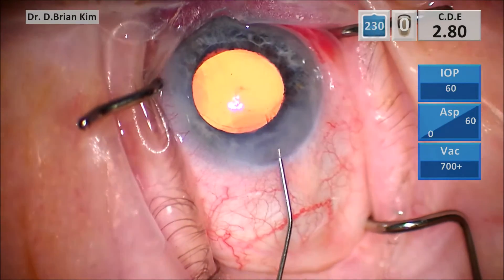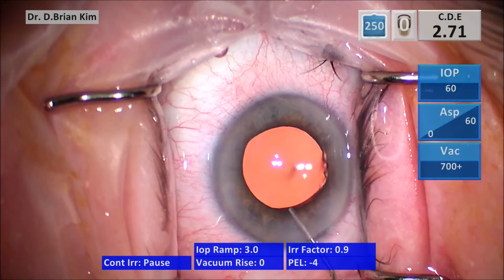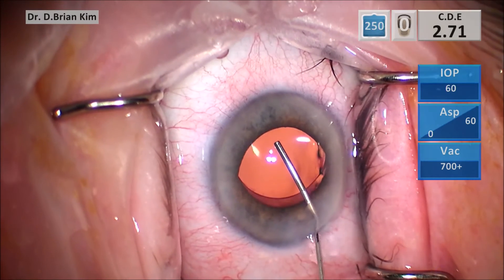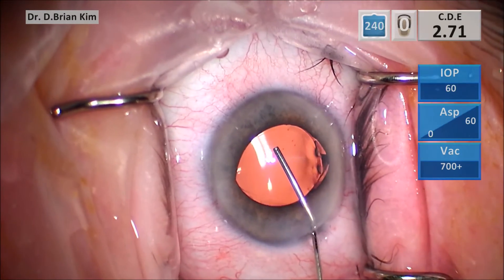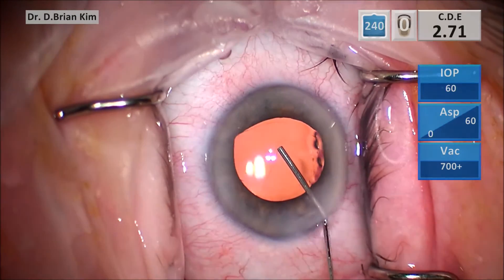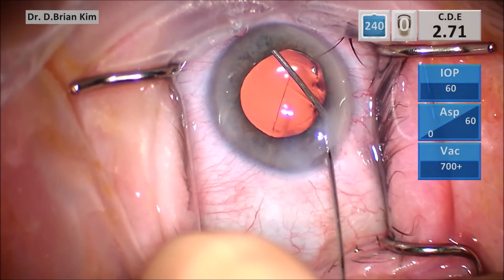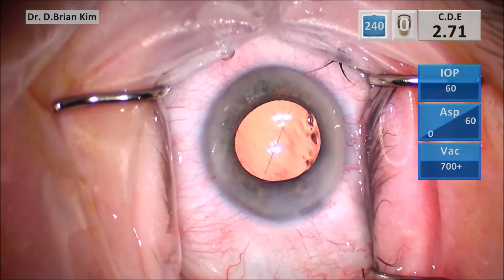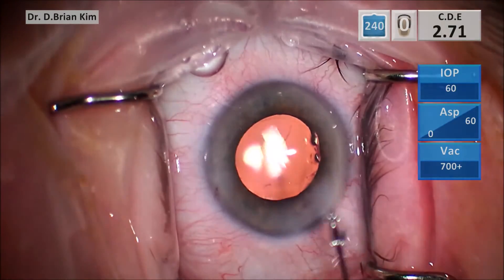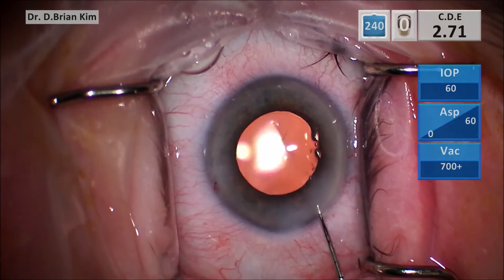For these lenses, you want to choose a power of 0 to plus 0.50 to reach an emmetropic result. The second case uses the same maneuver: BSS, push the entire time, go underneath the optic, push BSS to create a dissection space separating the posterior capsule from the optic. Tease the optic towards you and push upward while pushing BSS simultaneously. In this case, I found an edge where the iris was captured and pulled the cannula along the edge to release the iris capture. You can either push the iris peripherally or swipe the cannula along the edge to release the iris capture.